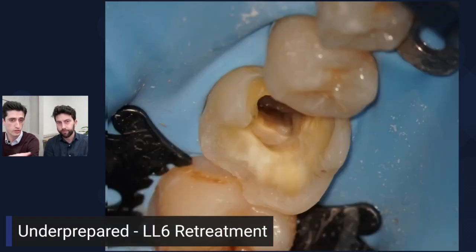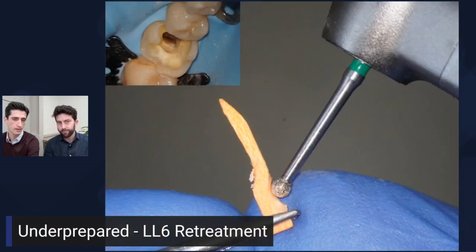Here we are towards the end of obturation. Worth noting — I quite like the quadrant isolation, which allows you to do both the endo and the restorative at the same time. Thinking about the restorative aspect: I want to build this up with composite. Distally, no bother, but mesially we have a fairly deep margin. Getting the band to fit and getting good adaptation of a wedge — I like a wooden wedge, very old-fashioned — will fit really nicely to splay things out. But with a conventional wooden wedge you can end up with deformation of the band at the base and don't get that nice emergence profile.